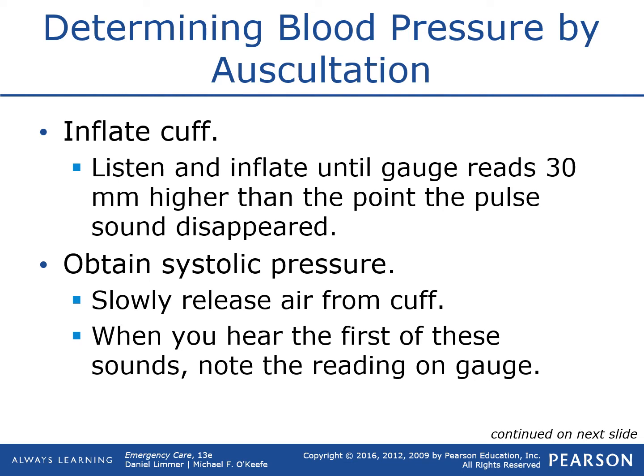And what we're listening for when we take a blood pressure is the actual heartbeat coming through, because that's pushing through the pressure that the cuff is putting on the artery, and you're going to be able to hear that. You should hear it from the point between your systolic and your diastolic. So if you listen in between that range, you should hear the heart rate going. The reason I tell you to go to 100 and listen is that it helps tell you if you're in the right area. What does it sound like for this patient? Different patients might be a little bit softer, might be a lot stronger. So this will give you a good idea of what this patient sounds like at baseline.